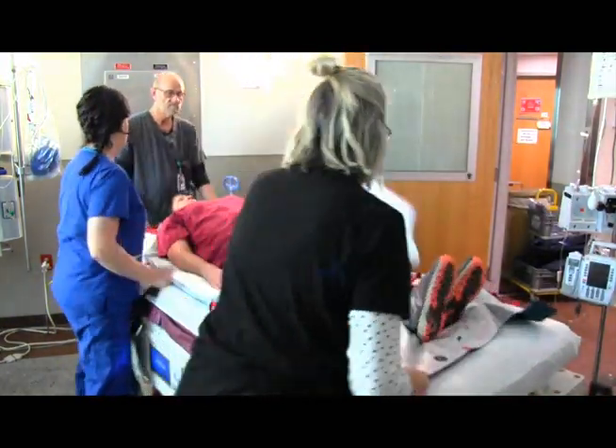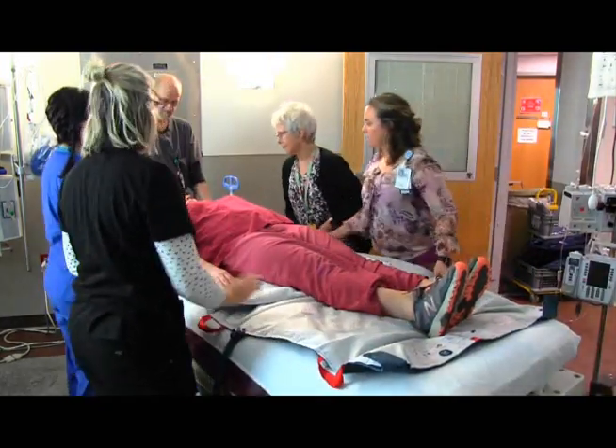Once the patient is placed in the supine position, again use the bottom mat to position the patient in bed.